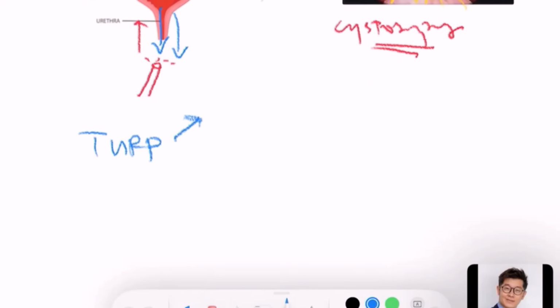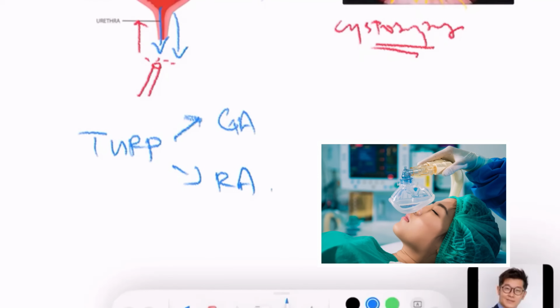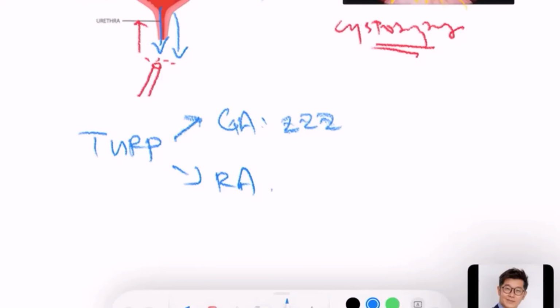There's a few ways that you can do TURP. You can do it either under general anesthetic, which is a very common way, or under regional. A general anesthetic is essentially whereby once you come into the theater, you take a nap, you go to sleep, you wake up in the ward, you have no idea what happens. Surgery is over. But it's not suitable for everybody, because you need to have a very good cardiovascular system or state of the heart, and there's always a small risk of stroke and heart attack, what we call AMI.